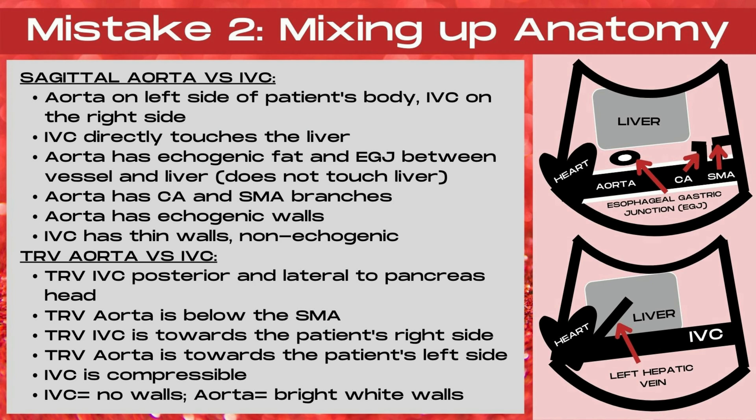Also note that the IVC is going to directly touch the left lobe of the liver. So when you're imaging, your left lobe of your liver is going to be on the top portion of the image, and then directly underneath that touching the liver is going to be your IVC. While the aorta is going to have echogenic fat and also the EGJ — that's your esophageal gastric junction — between the aorta itself and the liver. So the aorta is not going to directly touch the liver, and it's going to lie deeper on that ultrasound image than the IVC does.